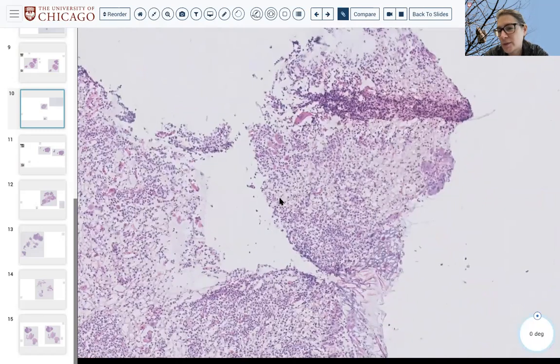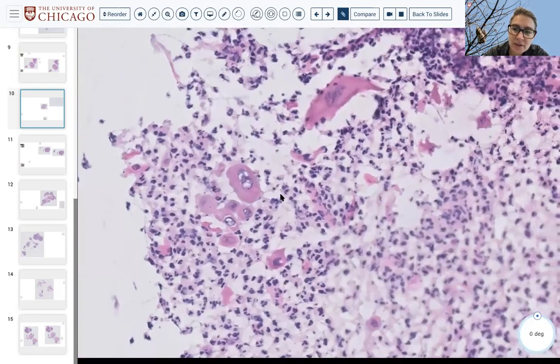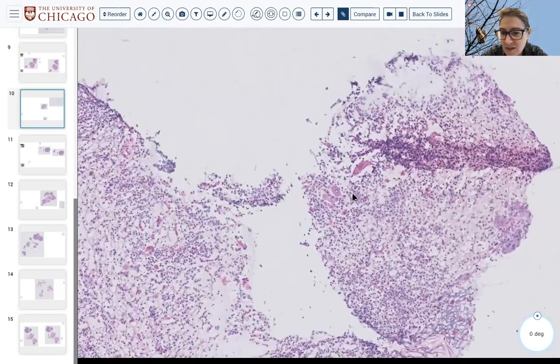Unfortunately, or fortunately, it doesn't matter. They aborted the surgery in this patient anyway, because it was too big for them to resect. Unfortunately, this was called negative at the time of frozen. But if you are judicious about your search, you'll find these isolated, highly atypical, keratinizing cells. This is basically cancer coming from below. Yes, this is cancer coming from below, because there's not too much, most of this is deep.